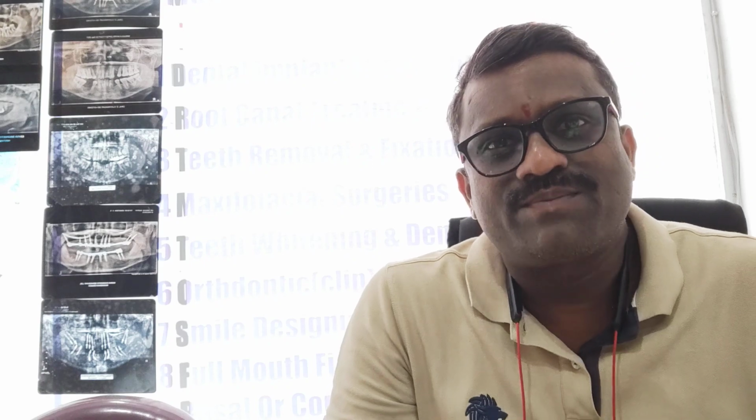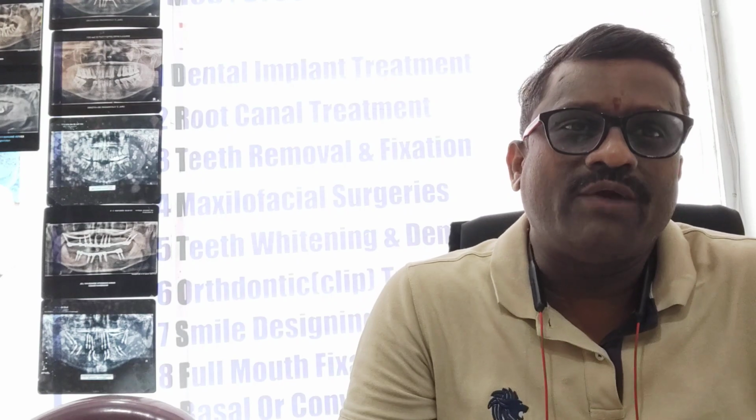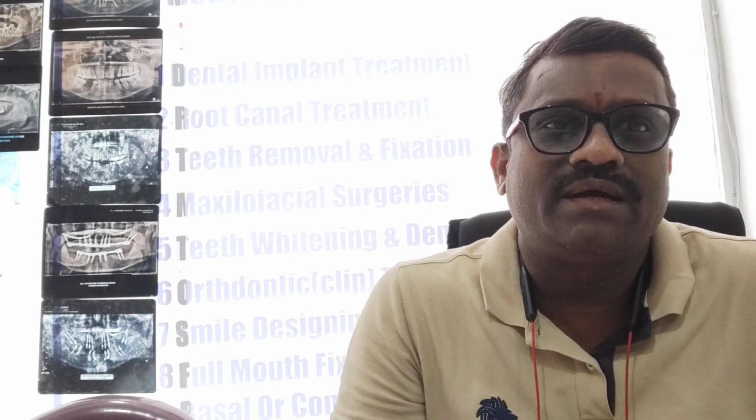Here the placement of the implant is done with a driver. Your driver should be compatible with your hand and have a firm grip so that you can apply pressure while placing the implant. You have to engage in the proper D2 bone so that the implant will be stable and give good stability and anchorage. So this is the difference in osteotomy, the comparison between conventional implantology and basal implantology.